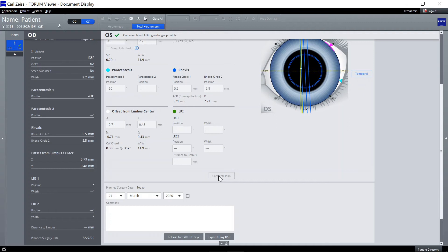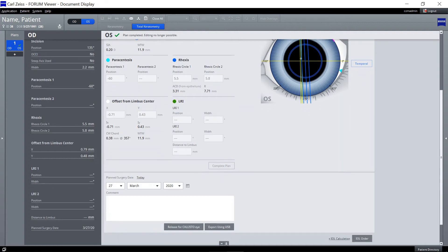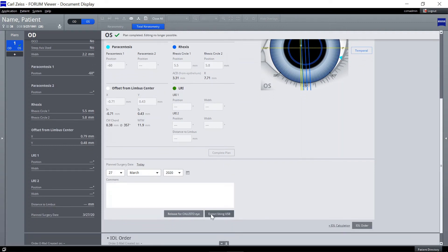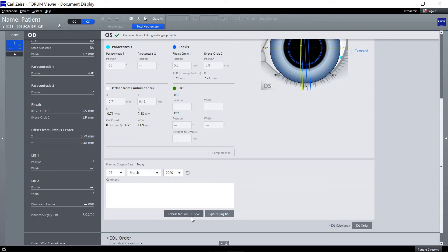You have now finished your surgery planning and can proceed to releasing it for Zeiss Callisto Eye and or ordering the planned IOL. Both steps can be performed by any user logging in to Zeiss EQ Workplace and do not necessarily need to be completed by the plan originator.